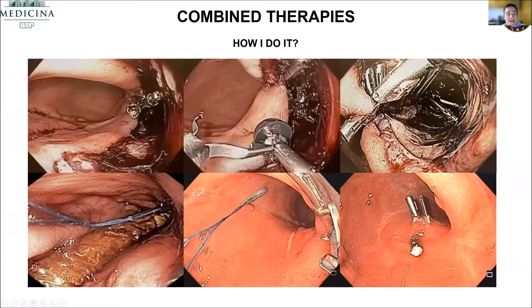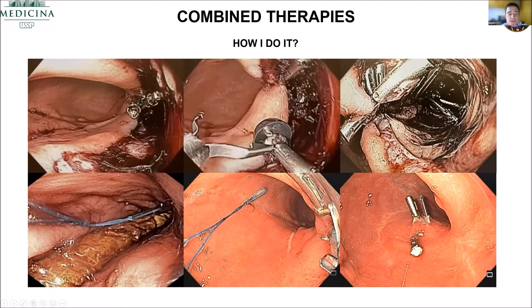This shows that endoscopy procedures can also have complications. I was doing a pneumatic balloon dilation in a sleeve and, as you can see, I almost opened the stomach in the middle. I tried to clip with hemoclips but couldn't do it from the intraluminal side. So I went into the cavity and placed clips externally just to approximate the tissue. Finally, I placed the endoscopic vacuum therapy. After 15 days, I removed the vacuum and the patient went home. This is the follow-up after three months — it's a really good approach, even as a rescue for a complication.